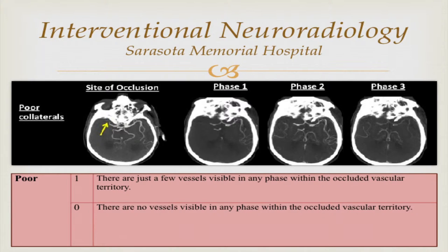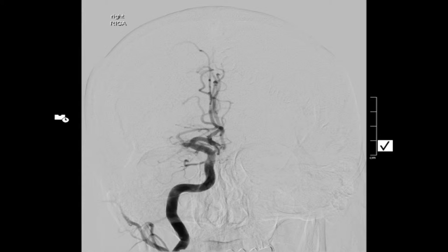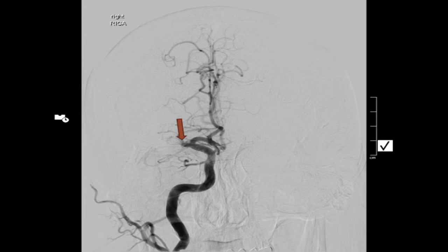So here's an example. This is a very interesting example. I love this. This is the angiogram in a patient with a right MCA stroke by symptoms and by CTA. Injected CAT scan dye into the internal carotid artery. Coming up, this is the anterior cerebral artery going up. They've got an ACOM, and so they're opacifying the other anterior cerebral artery on the other side. But then here's the M1 thrombus. So it's definitely blocked. That's a big block.